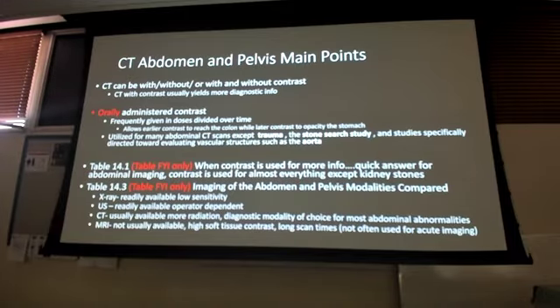Vasculature, right? To include the organs, because the organs have blood flow. So it highlights the liver, the kidneys, the pancreas, the spleen, all that good stuff. How do I see what's going on the inside of the intestines? Is blood flow going to go to the inside? Nah, it just covers the outer walls.